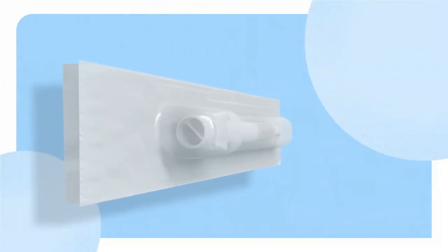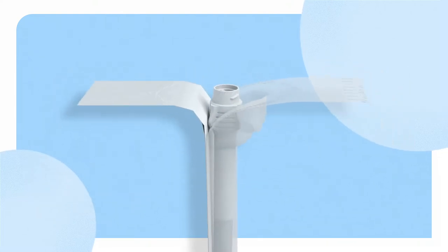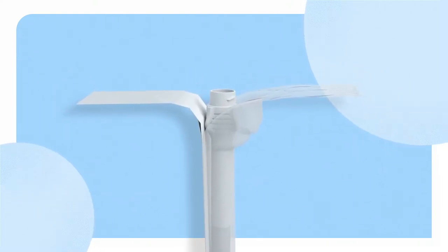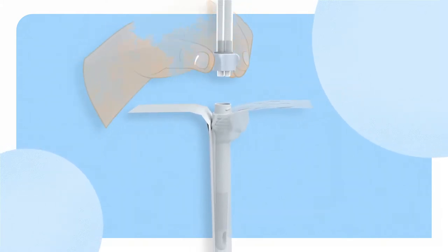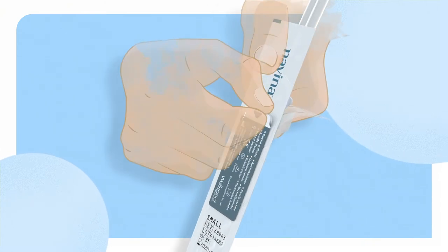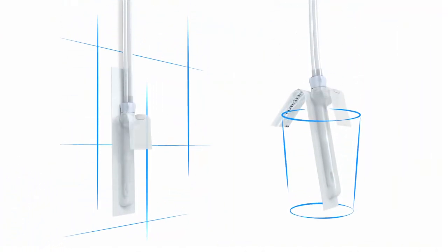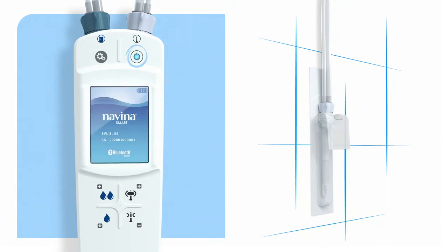To do so, first peel the catheter packaging open two to three centimeters to expose the catheter connection. Don't remove the packaging yet — you'll need it on for a few more steps. Attach the tube with the white connection to the rectal catheter. The packaging can be attached to a vertical surface or placed in a tall glass. Ensure the rectal catheter is within easy reach. Make sure your Navina Smart control unit is turned on.